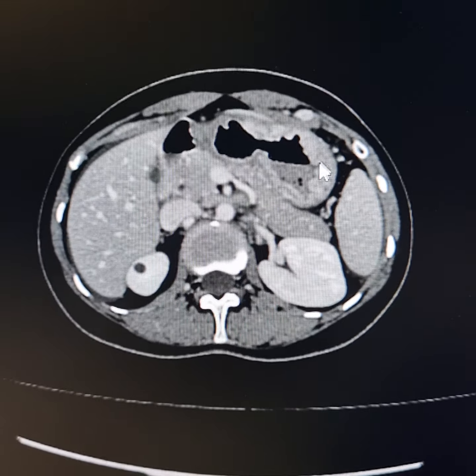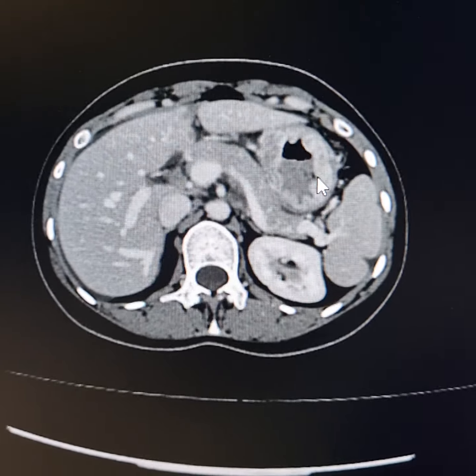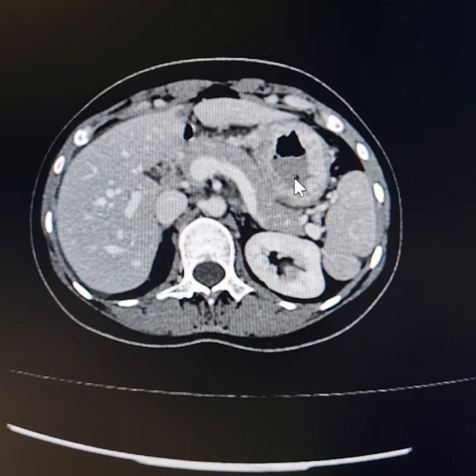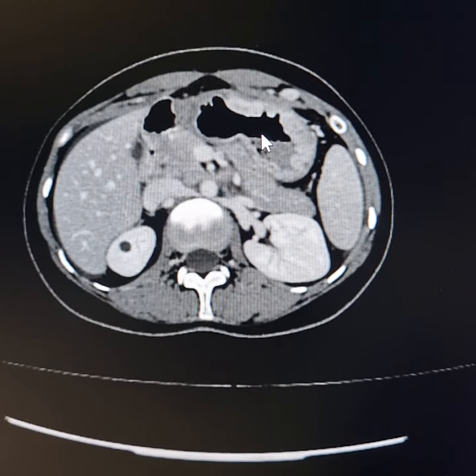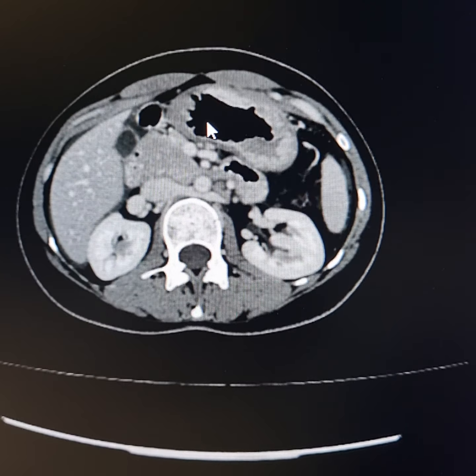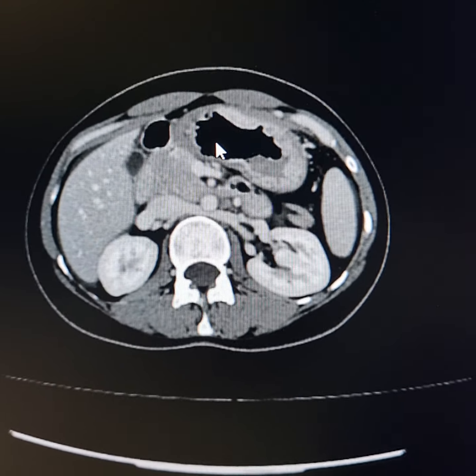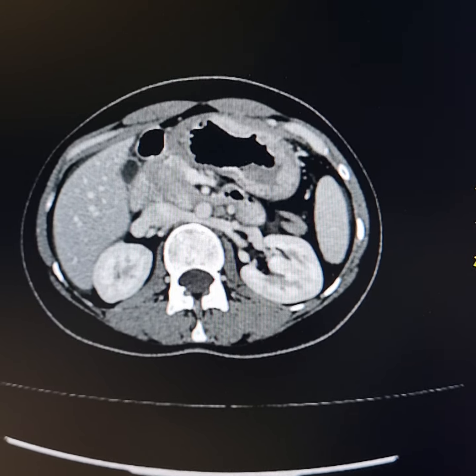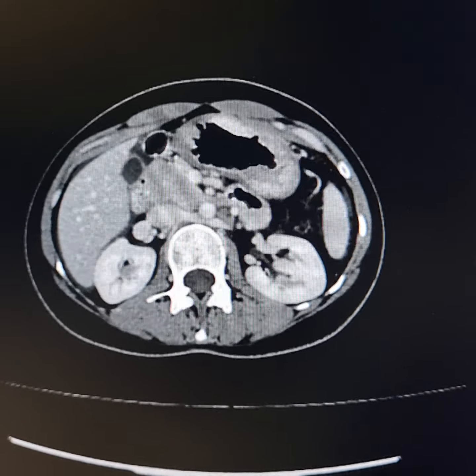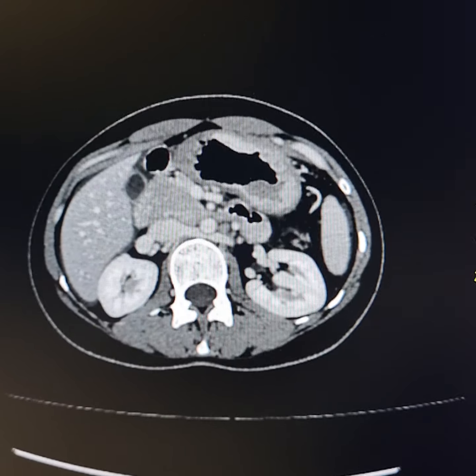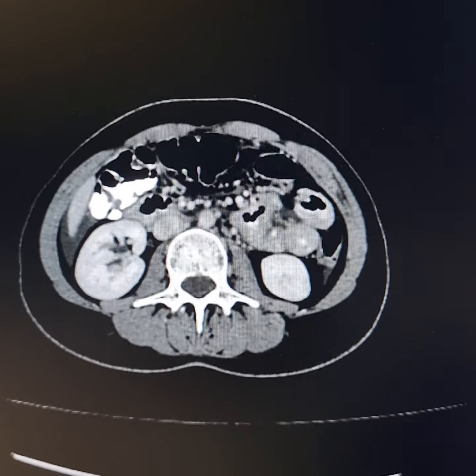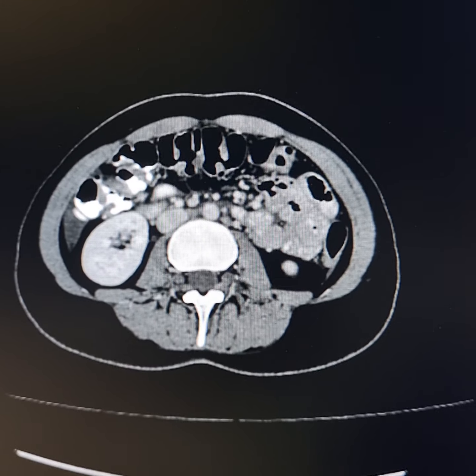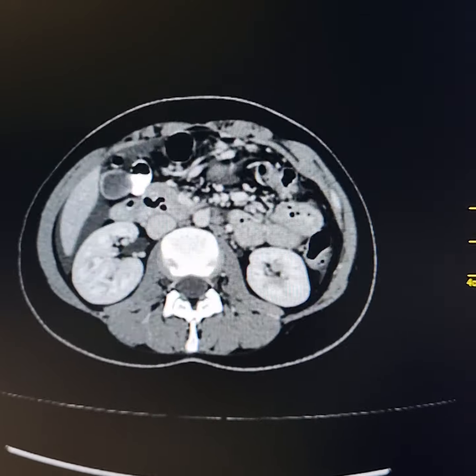This circumferential thickening of the walls of the fundus, stomach and proximal part of antrum extends up to this level. The distal part of the pyloric antrum is quite capacious and distended normally. Similarly, the pyloric canal is also normal. Contrast medium is passing normally into the duodenum, jejunum and rest of the small intestine.